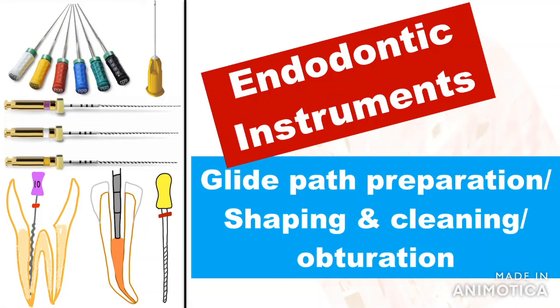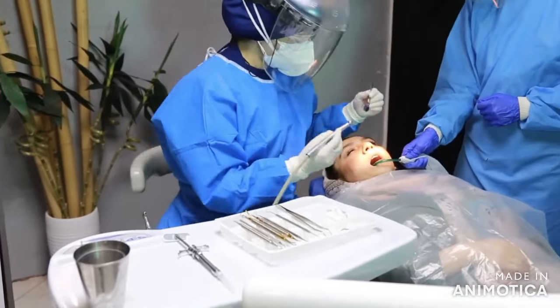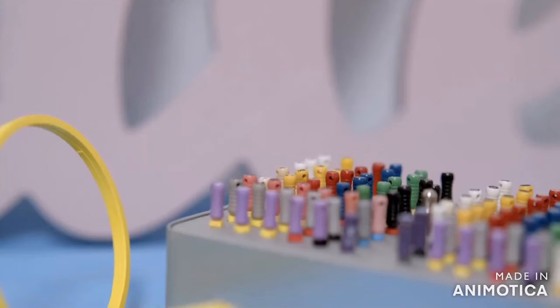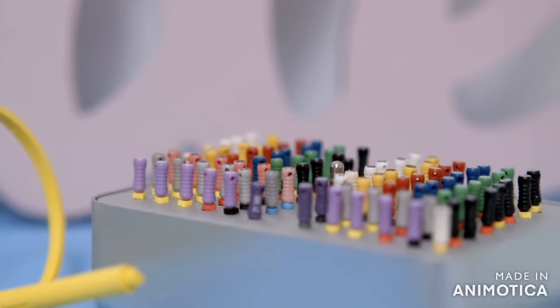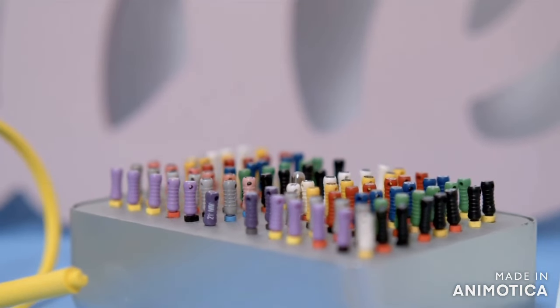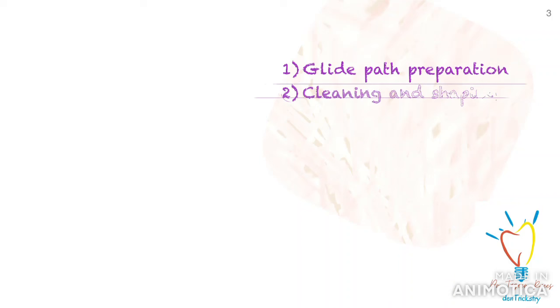Welcome back to the second part of endodontic instruments used in clinical practice. When I started doing the little endo work that I do, I was super confused about the basic armamentarium required for a root canal procedure. It was really overwhelming to see so many instruments marketed for this routine procedure. Over time, I learned about a few important ones. In this part, I am going to mainly discuss the basic instruments used for glide path preparation, cleaning and shaping, and obturation.